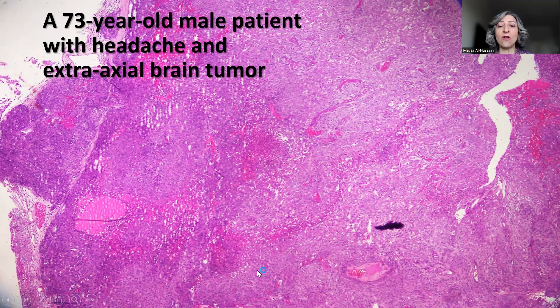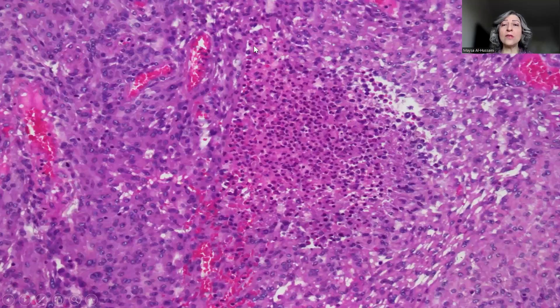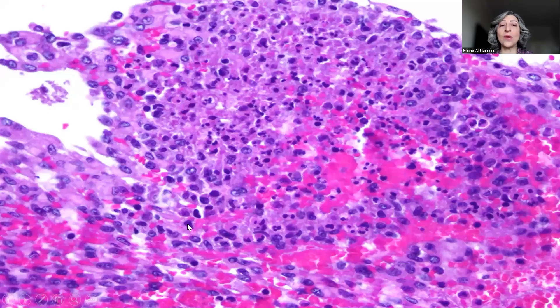However, there were areas of punctate necrosis here and there, and this is one of the areas on high-power magnification. This is a focus of punctate necrosis that is identified, as well as another focus of necrosis.